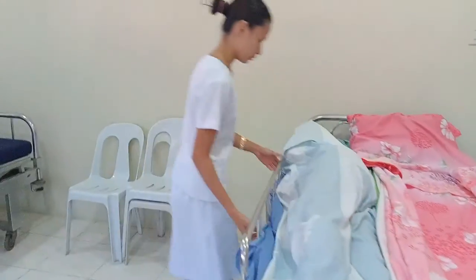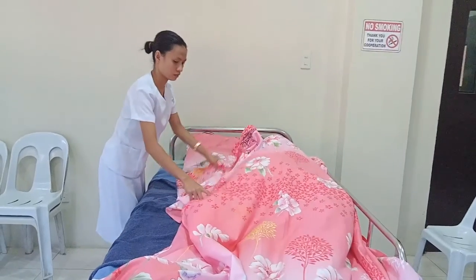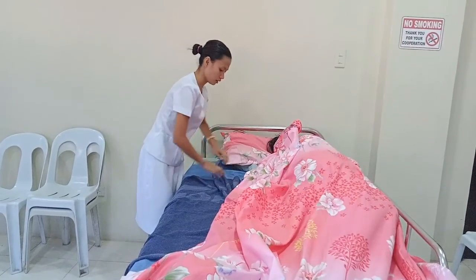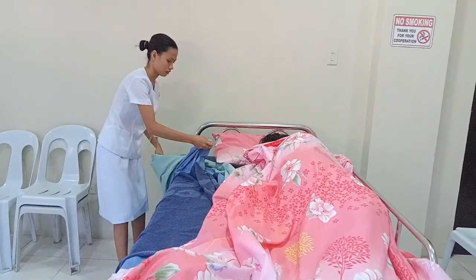Move to the other side of the bed and lower the side rail. Remove the used linen and place it in the portable hamper.